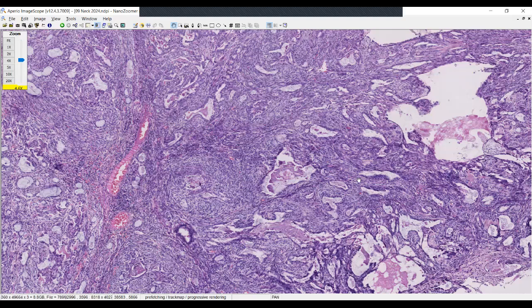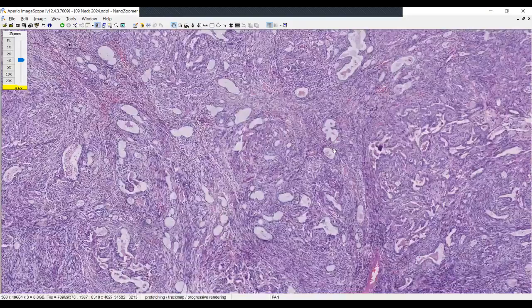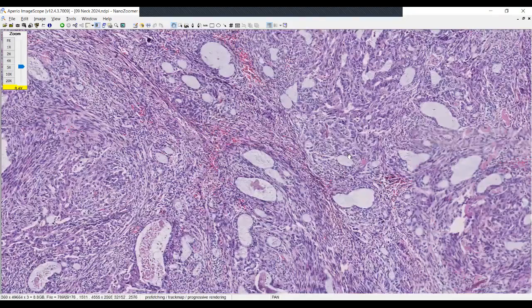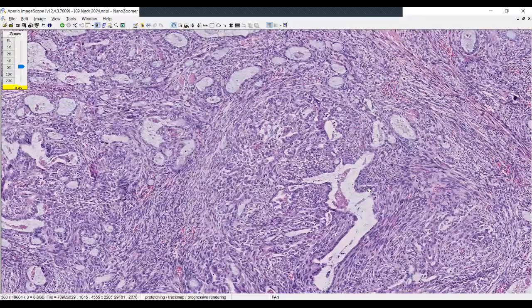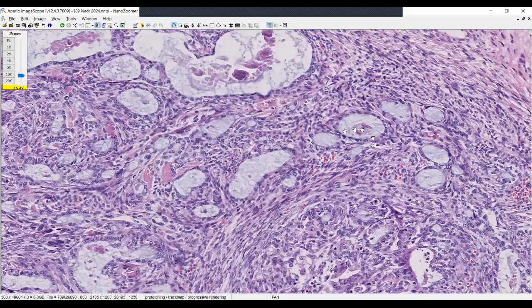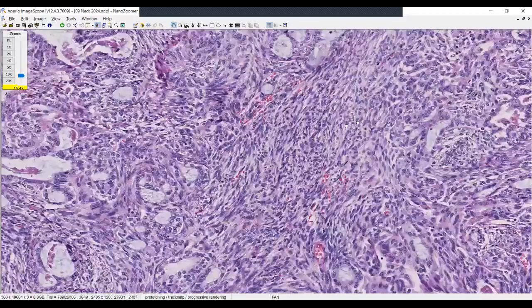But SETTLE does tend to have much more fibrous connective tissue that separates it out. It also tends to have much less pleomorphism and variation than you see in this example, and also tends to have a little bit more of an inflammatory background that is not present here either. I would also think, is this actually an example of a thyroid neoplasm where there is a papillary carcinoma with a spindle cell stroma?